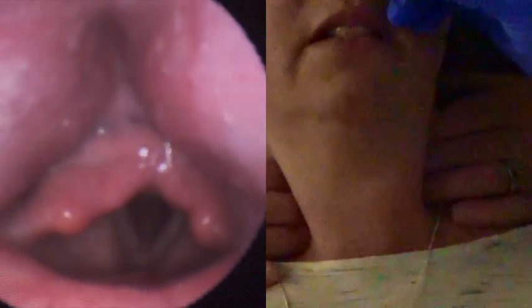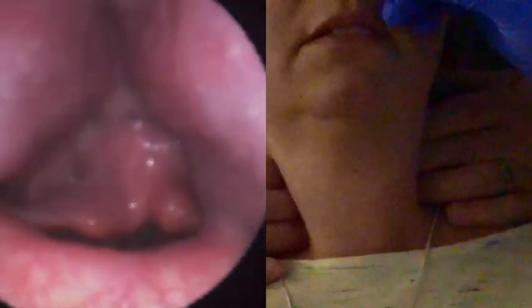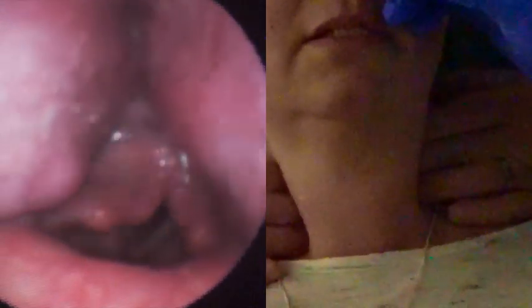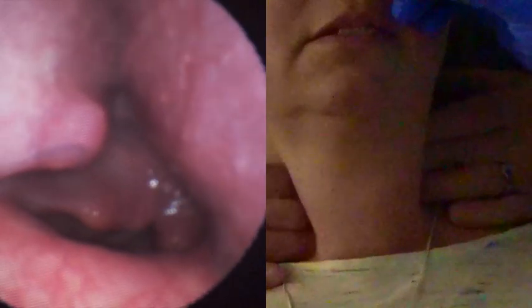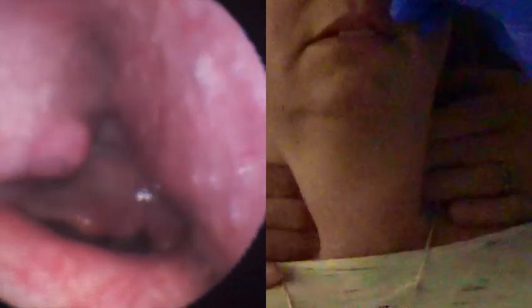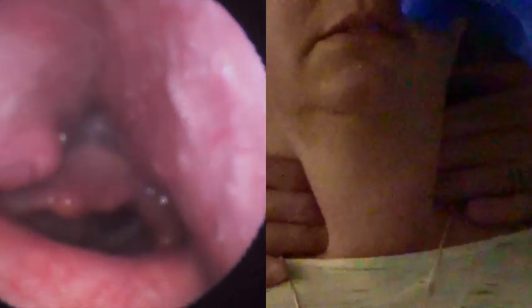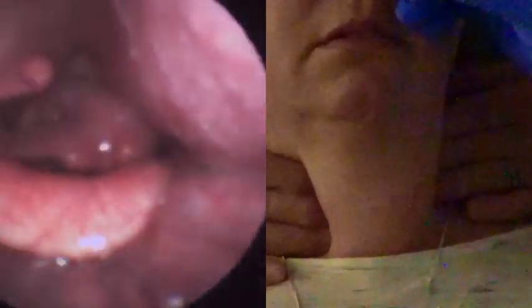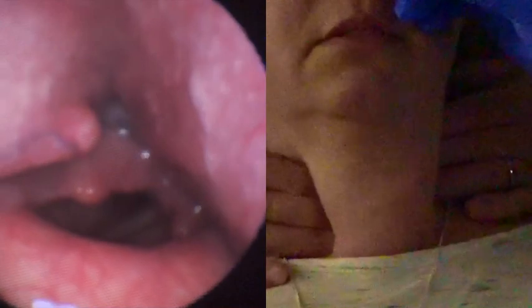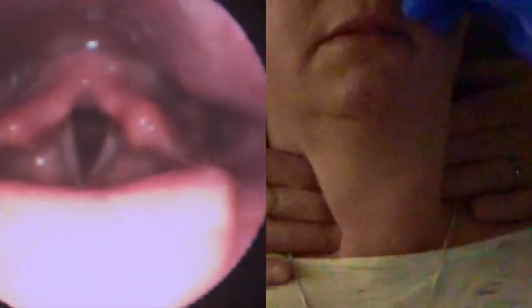What I'd love to see is if we can get more action on her left side before we finish up here, right there. Now, you're not able to see the thyroid cartilage itself really well here, but I'm behind the thyroid cartilage, picture that, right? In front of the spine, behind the thyroid cartilage, and I'm ever so gently, this sounds odd, but prying my fingers under it and pulling the thyroid cartilage forward. Do you feel any of that, Amy? I can feel that forward. Yeah, the anterior displacement of the whole larynx, really.